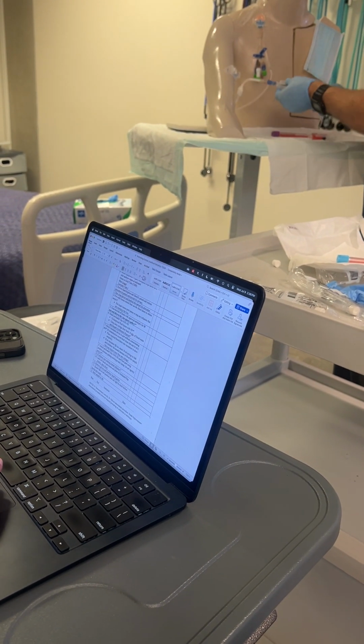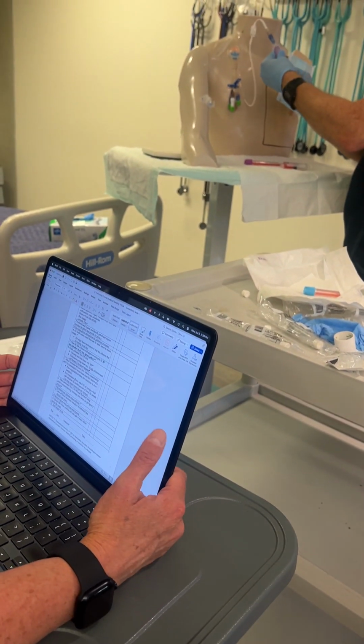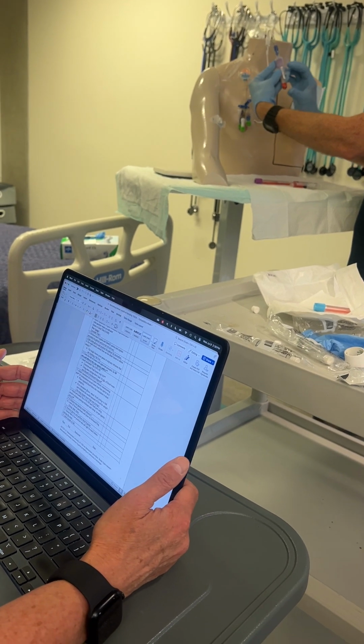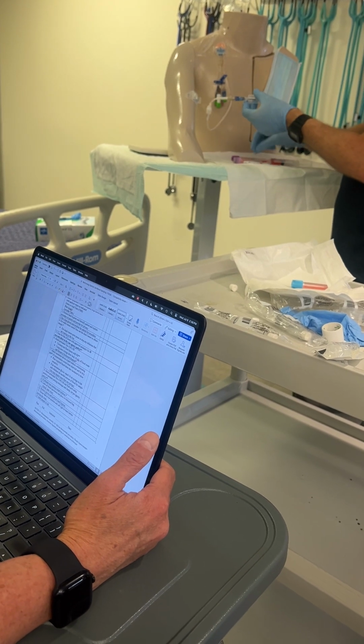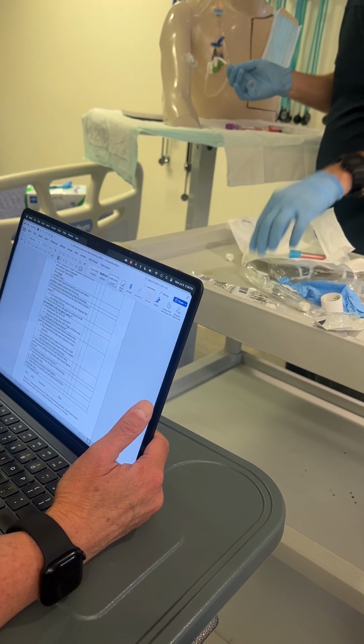So I got this. For your skills demonstration, don't worry about it. Most of the tubes are not going to have any vacuum in them, so we'll just say it's full. And this one fills, right? Ish. Okay, so I've got my lab tubes here. I've locked this. I got my flush.